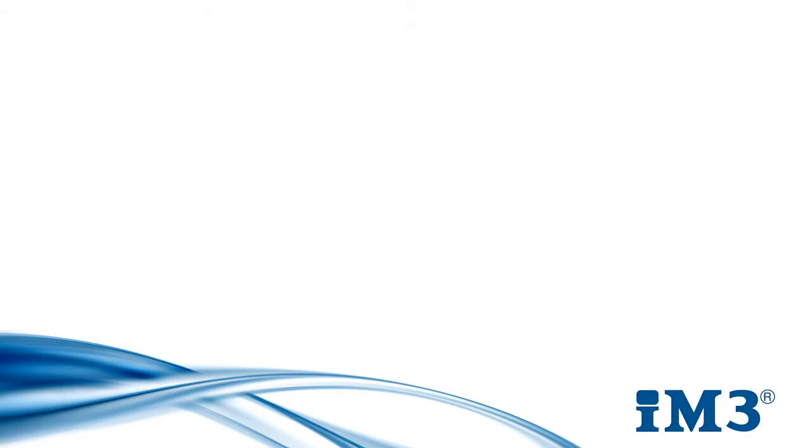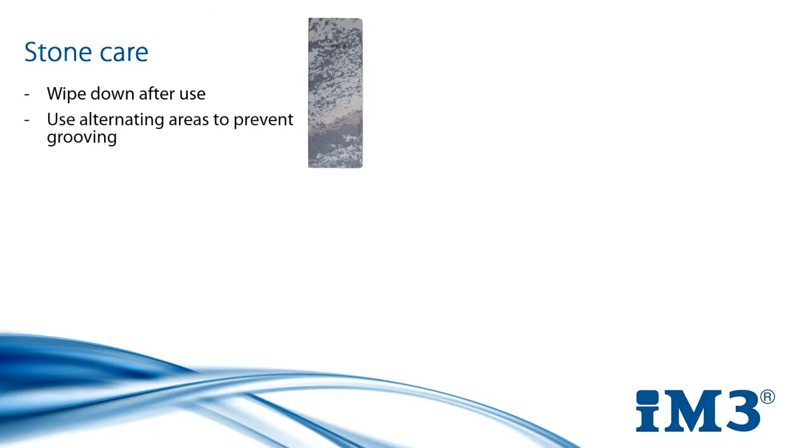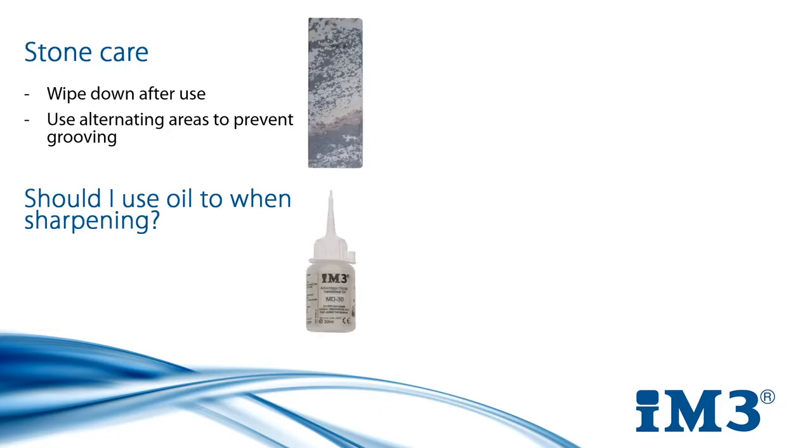If maintaining your instruments is important, so is maintaining the equipment you use to do it. Sharpening is done using a specially shaped and textured stone. To keep it working well, it's a good habit to wipe it down after use to remove the debris. It's also a good idea to alternate where you sharpen on the stone to prevent little dips and grooves developing and therefore damaging the flat surface of the stone and sharpening instruments incorrectly. Many people are unsure if they should use oil when sharpening — while it isn't an absolute must, it has its benefits. Using oil is a good net to trap all the residue from filing and helps lubricate the stone to avoid excess friction, leaving a nice surface finish on the blade.